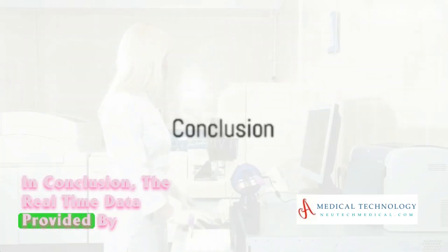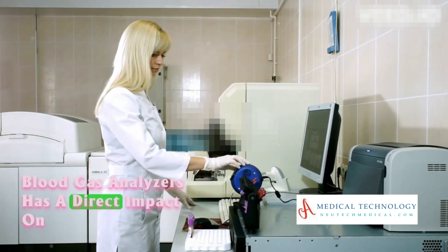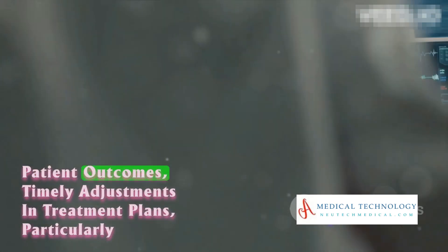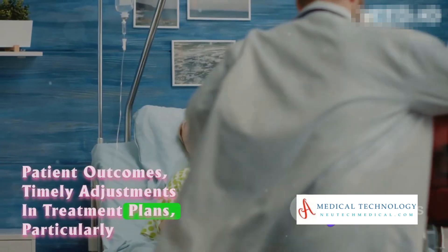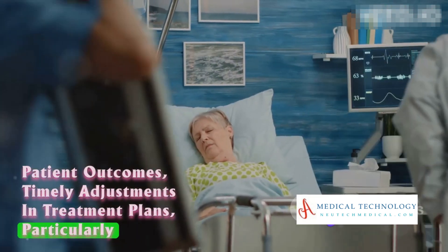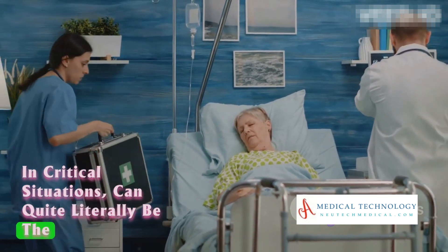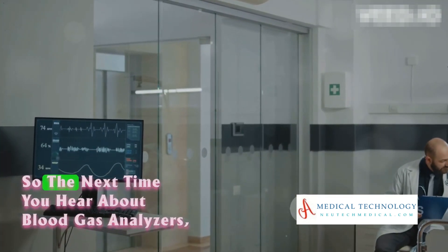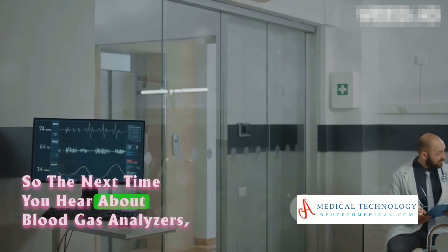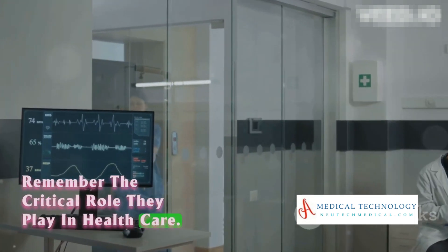In conclusion, the real-time data provided by blood gas analyzers has a direct impact on patient outcomes. Timely adjustments in treatment plans, particularly in critical situations, can quite literally be the difference between life and death. So, the next time you hear about blood gas analyzers, remember the critical role they play in healthcare.